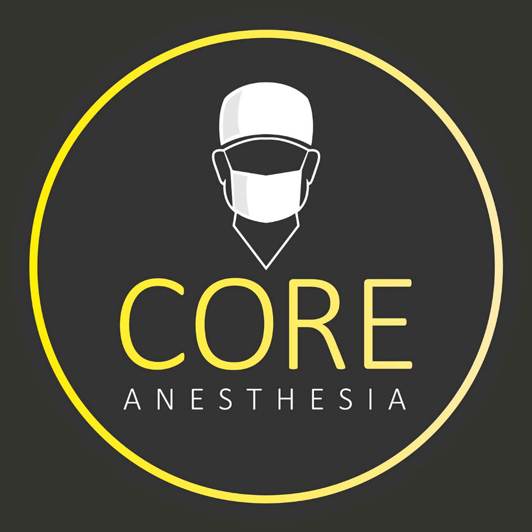I see the epiglottis, I'm in the vallecula. Why am I not getting a good view? And simply it's just taking an extra second to go a little bit further into there and getting better leverage on the epiglottis. And so I would tell you, just take things nice and slow. Be very purposeful with what you're doing when you're trying to gain an airway, but take things slowly and make steps purposefully. Walk through all the steps.